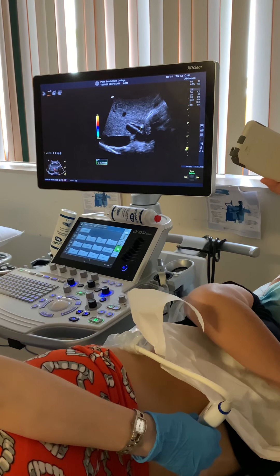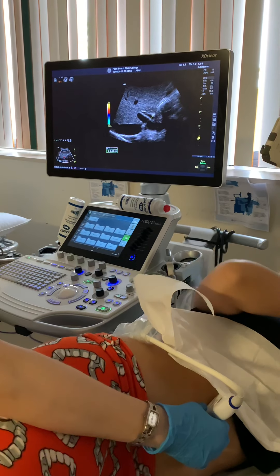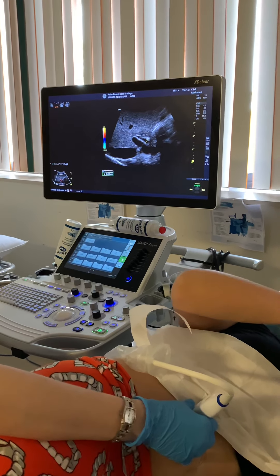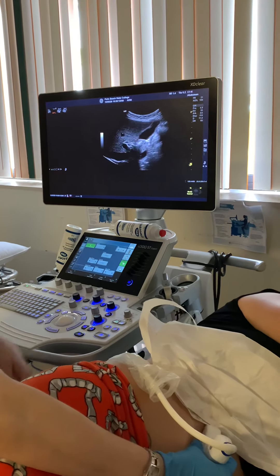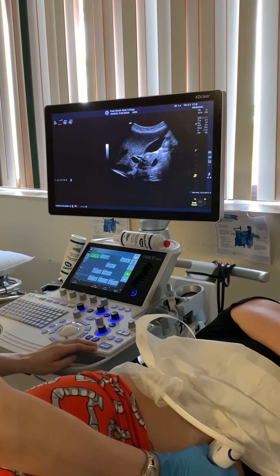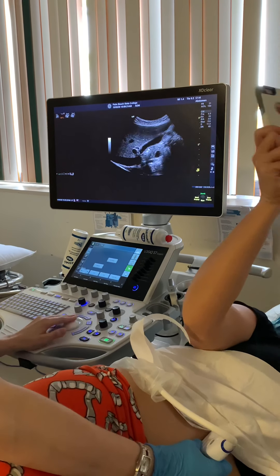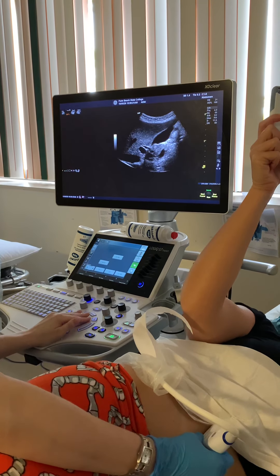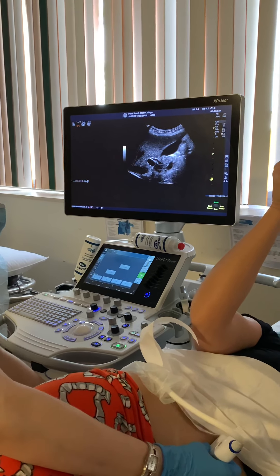Even though you're on your side, you're still kind of in the rib region area. Remember there are different ways to get the same picture — you can come over here and angle that way, or come down here and angle this way; it depends on the patient. Usually I'll take a look at the gallbladder — I'll show you my little trick. Take a big breath and hold it. You have your gallbladder in that exclamation point view, and you just angle a little bit from that area and then your CBD will come right into view. You have your portal and your gallbladder, and then you just tweak your probe and lengthen out your portal in that image and your CBD will lengthen out as well.